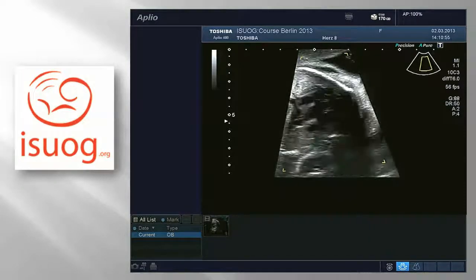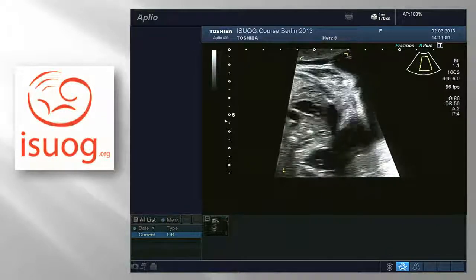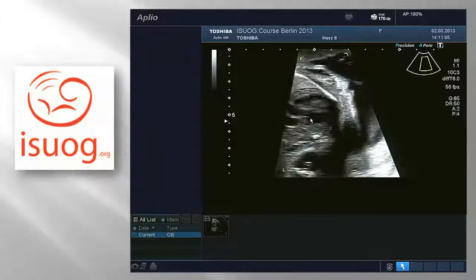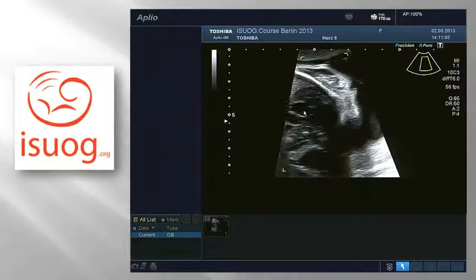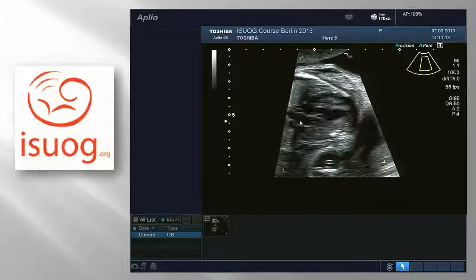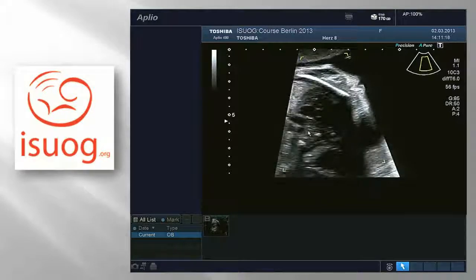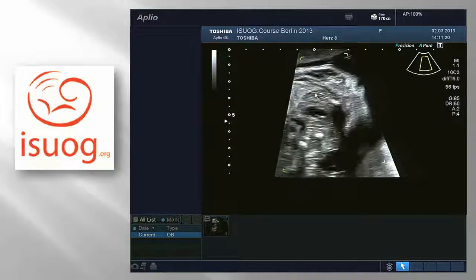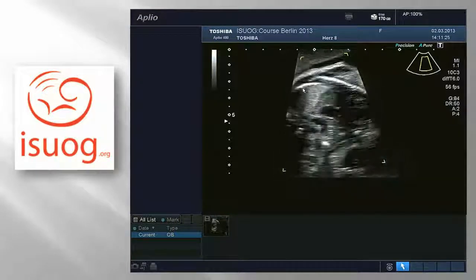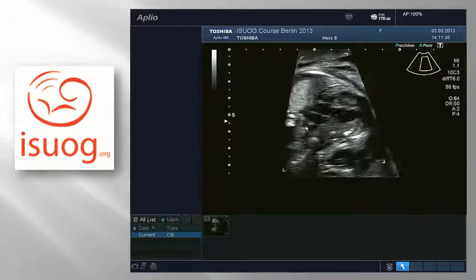And then a bit more tilting towards the right ventricular outflow tract. There we have our right ventricle in here, pulmonary valve, main pulmonary artery, and the aorta that was coming from there, forming the middle vessel in the three-vessel view, the SVC to the right. There's the thymus, quite nicely shown. Different contrast from the lungs. And that's the aortic arch with the trachea just here.